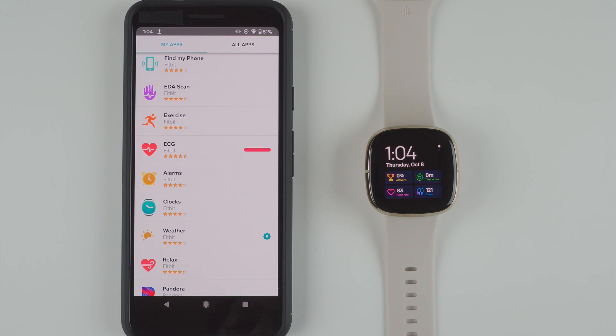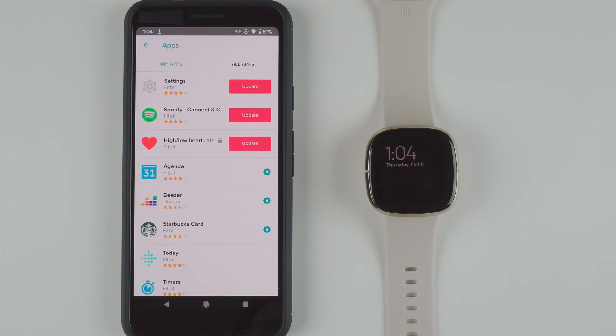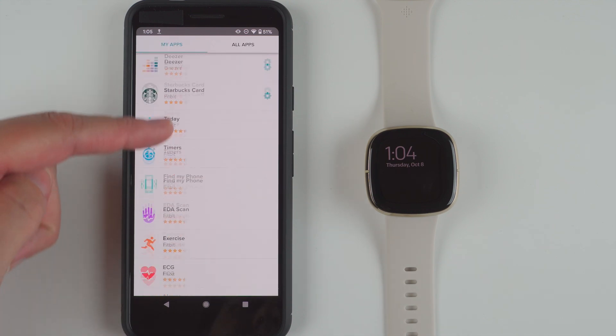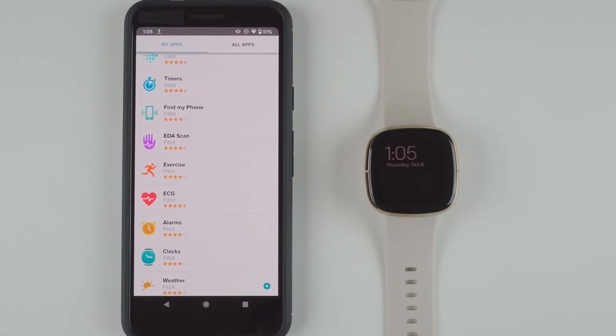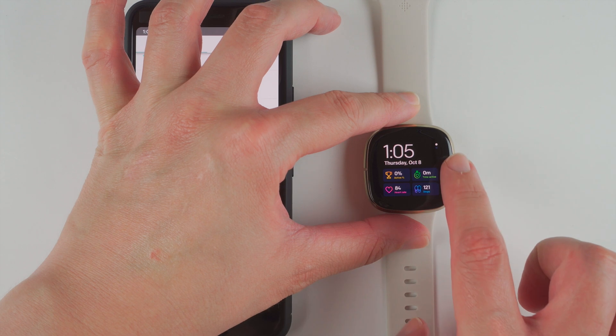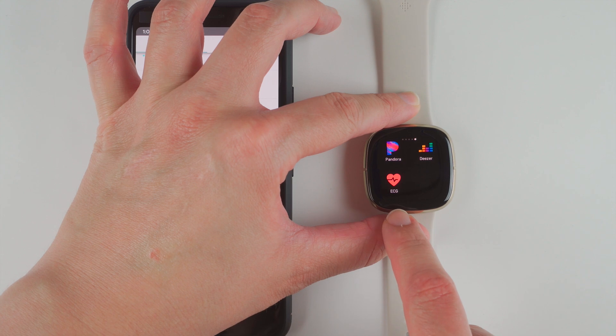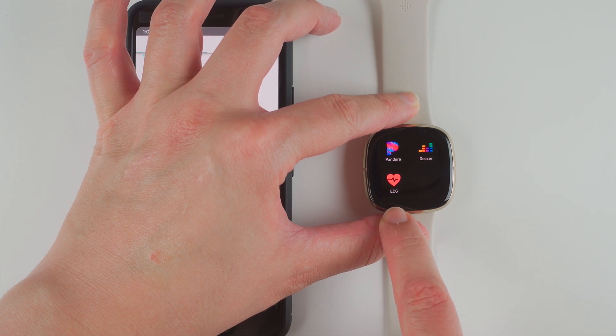It looks like it's full, so maybe the download is done and now it's installing to the Fitbit Sense itself. Okay, we no longer have a progress bar, so I'm going to go ahead and tap to wake up my Sense, swiping to reveal the apps — and it's probably at the end now — and there we go, we have the ECG app.